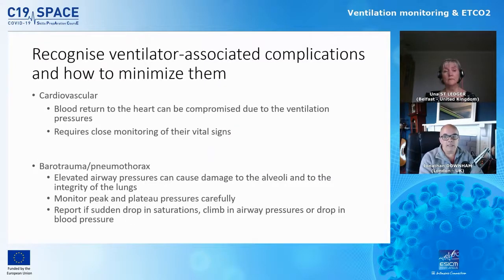Recognizing ventilator-associated complications is quite important as well. Putting somebody on a ventilator can sometimes cause a lot of problems. We don't want them ventilated for very long because of the problems that it can cause. So this is why we're keen to get our patients extubated as quickly as is safe to do so. And going back to some of the signs and symptoms that we look for, you will understand, hopefully, when we should be doing that.